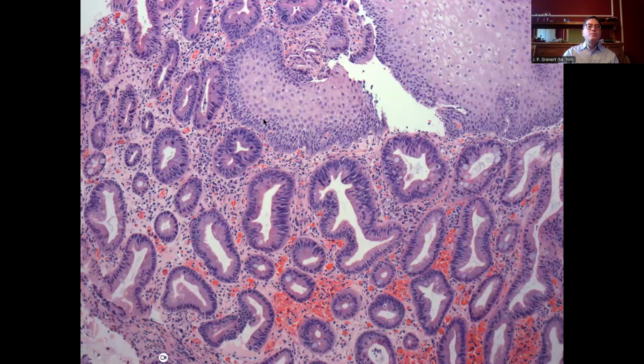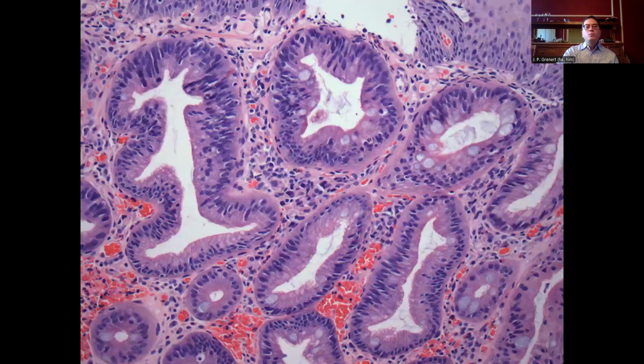So this is an example of intestinal metaplasia, but instead of our prior case, we see a lot of really dark staining nuclei, and they're really crowded in here. And so this kind of stands out as looking different than our last case, which had really pale staining nuclei that didn't really jump out at you, certainly at this magnification. When we look on higher magnification, we can see a lot of crowding. A lot of the nuclei are kind of going up and down, so that we call it pseudostratification. So the nuclei don't keep their normal basal location.